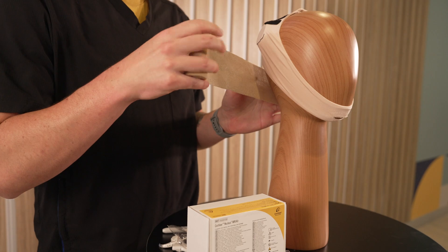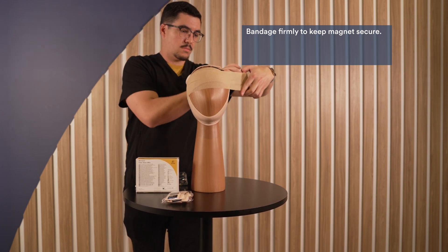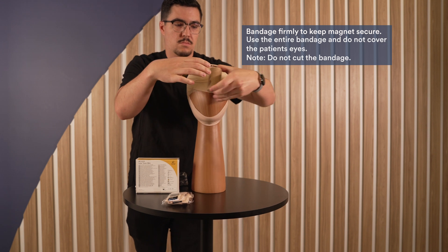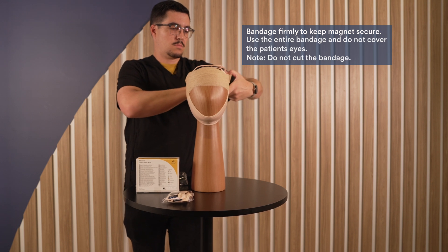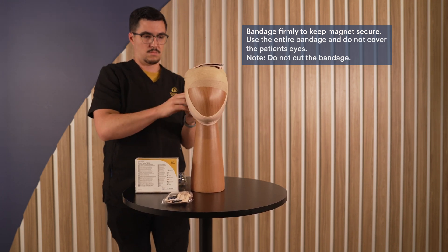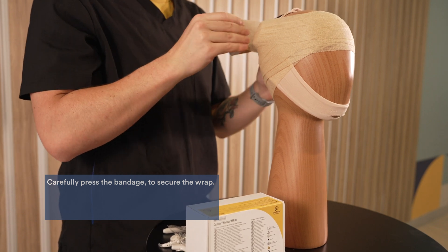Start at the base of the skull and begin wrapping around the forehead, maintaining tension. Bandage firmly enough to keep the magnets secure, but not so firm that it will cause pain or discomfort. Continue bandaging until the entire bandage has been used, then carefully press hands around the bandage to ensure layers have adhered and the wrap is secure.